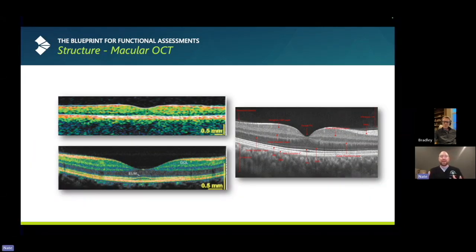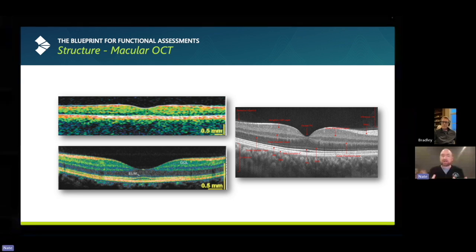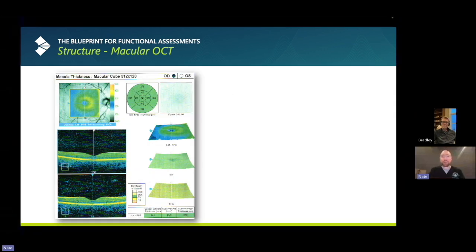And the point of this slide is how OCT technology has evolved tremendously over the last 25 years, from time domain OCT with the Stratus OCT to spectral domain OCT, and the resolution has got better and better, and the scan acquisition time has gotten better and better over the years, and the ERG technology has done the exact same thing. It has evolved over time. We'll talk more about that in just a second. So OCT, structure, it's a must. When I poll the audience, optometry now is saying between about 75 and 90% of optometrists have an OCT in your practice. Keep doing your OCTs. Keep doing them. It's amazing technology there.